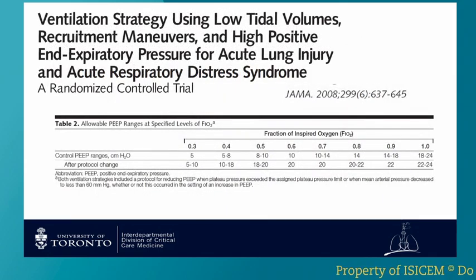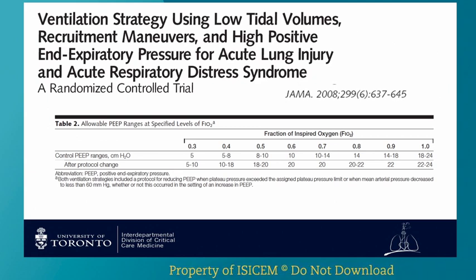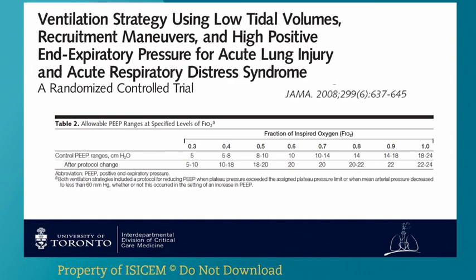So you could use a PEEP FiO2 table to set PEEP. And lots of people malign this as being too formulaic. But actually, if the patient's reading their physiology book correctly and they are a PEEP responder, then this actually might work and help you set higher PEEP in patients who are more recruitable.